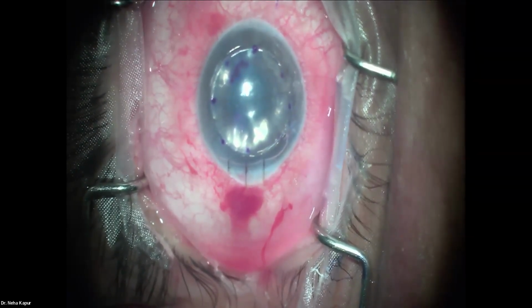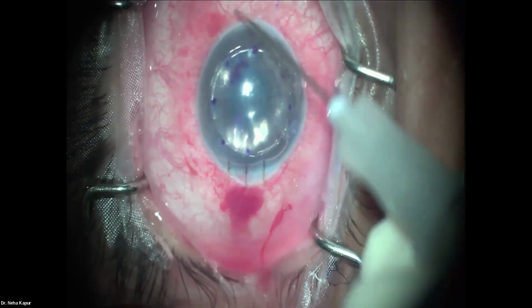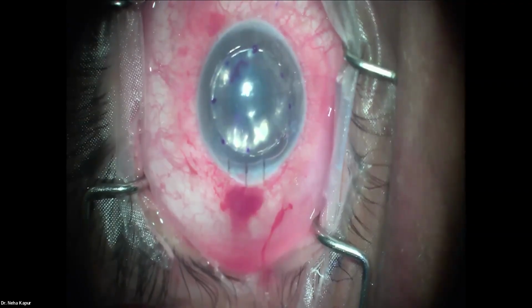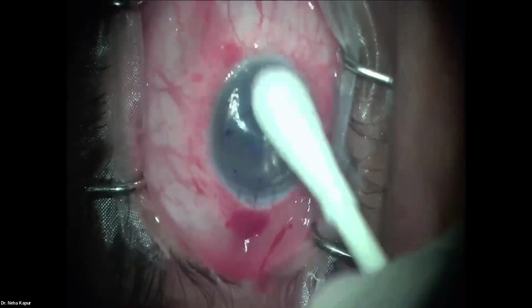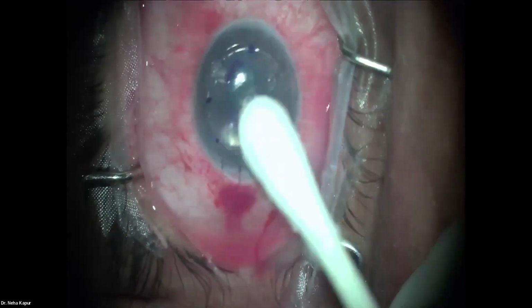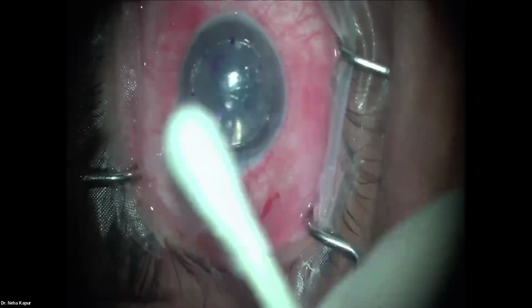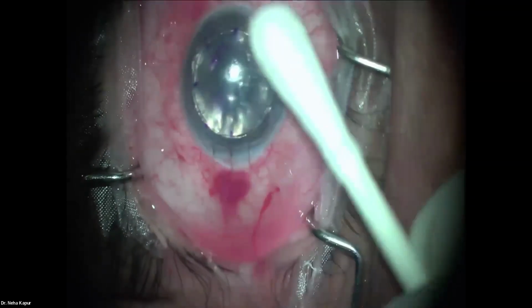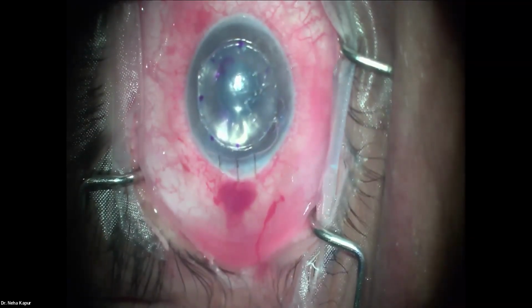What is your post-operative regimen for a post-DSAEK patient? Usually we give an antibiotic for about the first week. A lot of times we take out the epithelium if the view is not very good. Here the view is reasonably okay, but this is sometimes loose epithelium and probably better to take out rather than leave it on the eye. In about 3 to 6 days, the epithelium would usually grow back, so we give them an antibiotic until the epithelium has completely grown back on the surface.